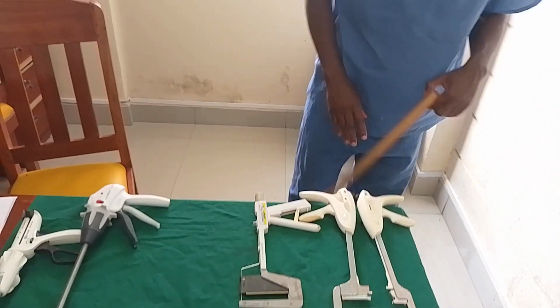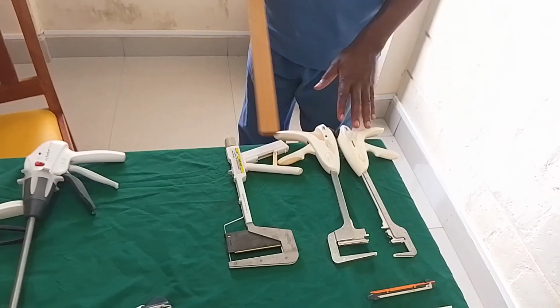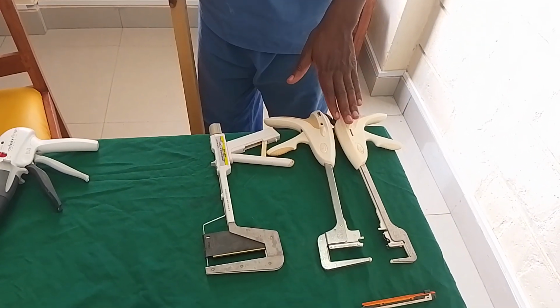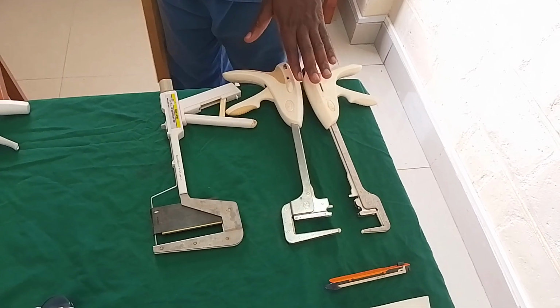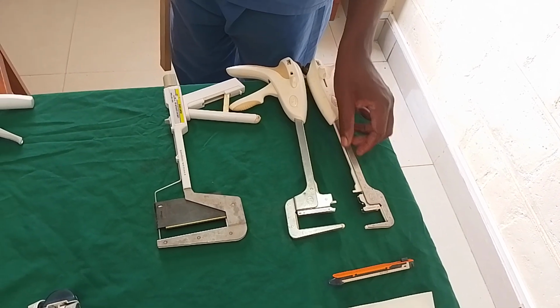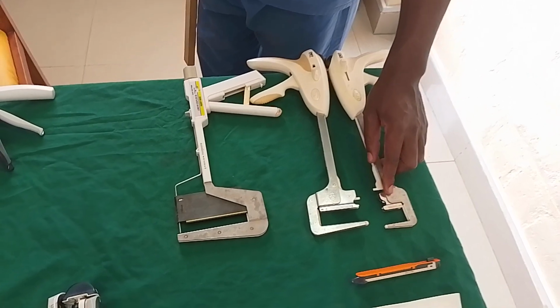So, number one, these are TA. We say TA, transverse surgical anastomosis devices. They come in different sizes. As you can see, we have a small TA that comes at 30 millimeter.